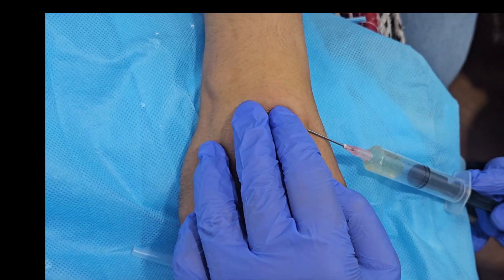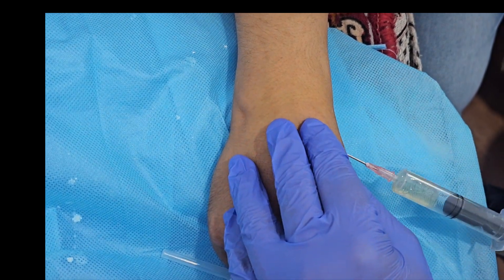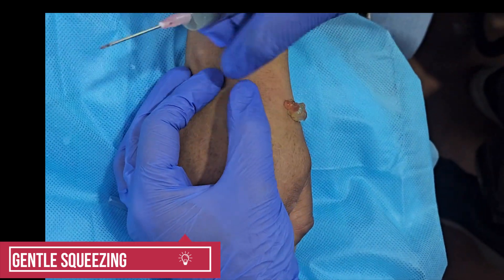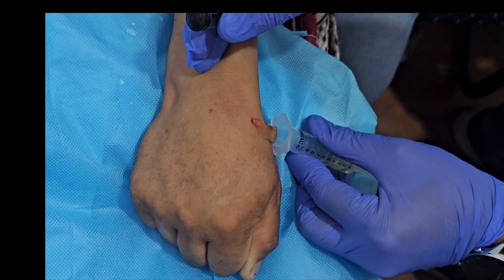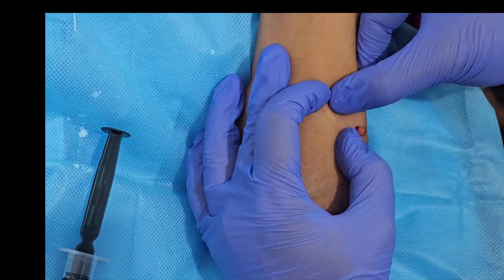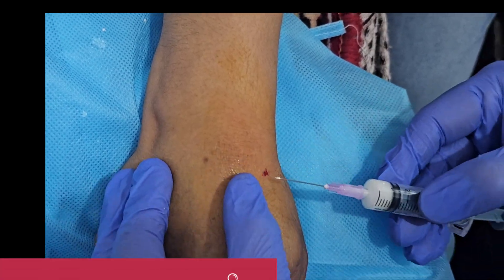We have to maneuver the direction of the needle to completely aspirate the contents of the ganglion cyst. Once we have aspirated as much as possible, the syringe is removed. By gently squeezing the cyst from different directions, you can see the rest of the contents coming out as well. The contents are taken back into the syringe, and again we squeeze to express any remaining contents, until the swelling has dissipated.